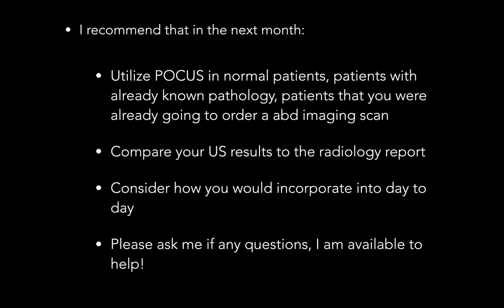So this is the end of this month's talk. And so basically, again, I encourage you to utilize POCUS in normal patients, patients with already known pathology, patients that you're already going to order an abdominal imaging scan. So that way you can really gain the confidence in figuring out if what you're truly seeing is truly there. Compare your ultrasound results to the radiology report. Consider how you would incorporate this in your own day to day and how this could be helpful for you. And let me know if you need anything.